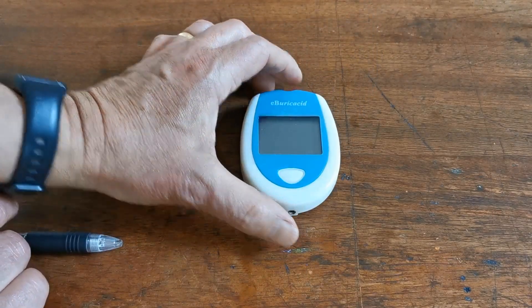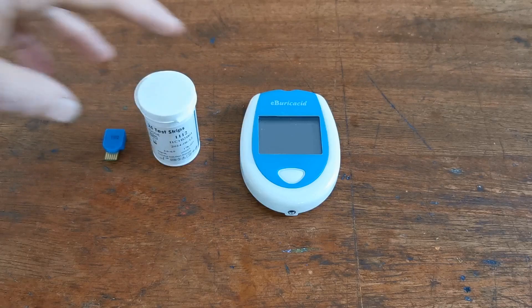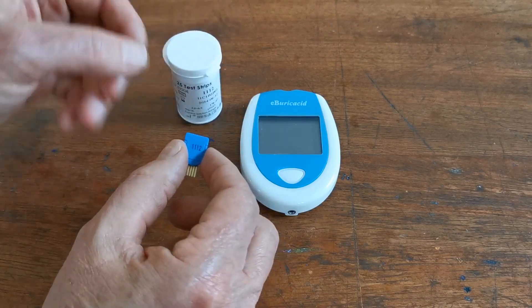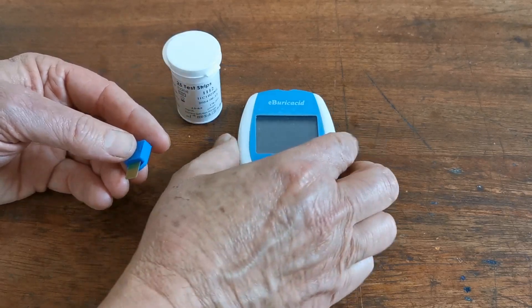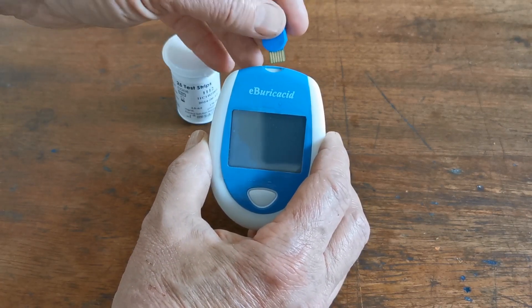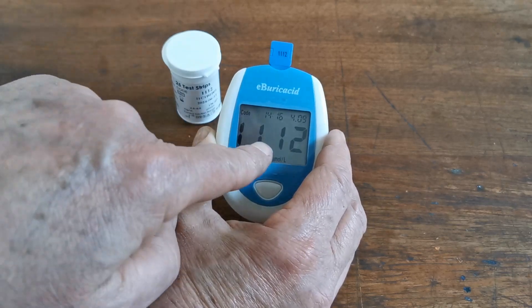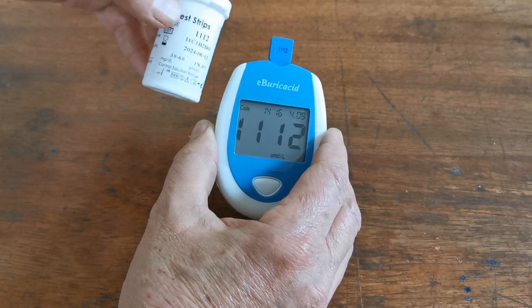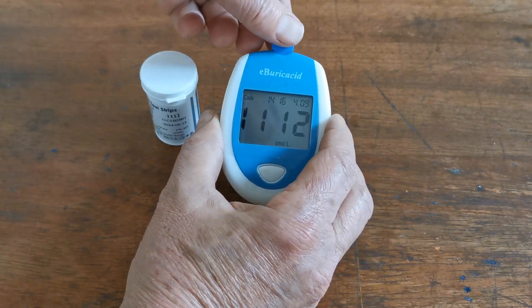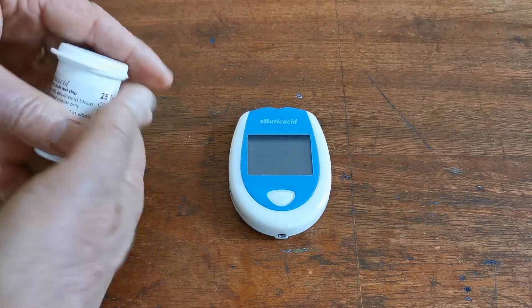Each time you purchase new EB-Uric Acid test strips they will come with a specific lot or batch number and a code chip. Before you use them you need to apply the coding — the calibration settings for that batch. Insert the calibration chip into the top of the meter. It will show the batch number, which is 1112 — check that number matches both the code chip and the side of the test strips. The code chip can then be removed, and the calibration for that set of test strips is fully loaded into the meter.